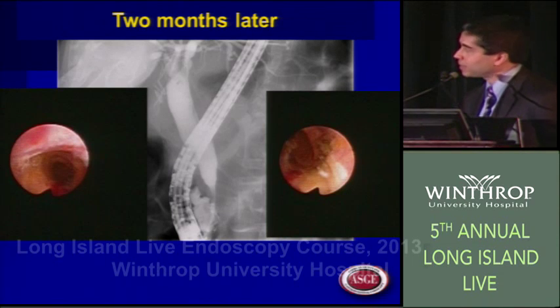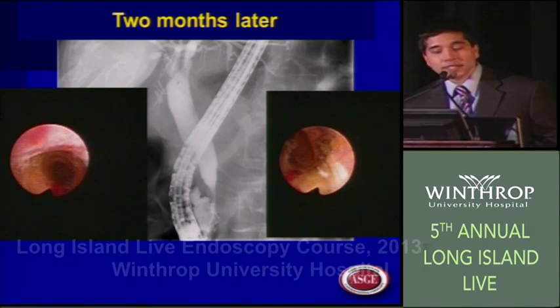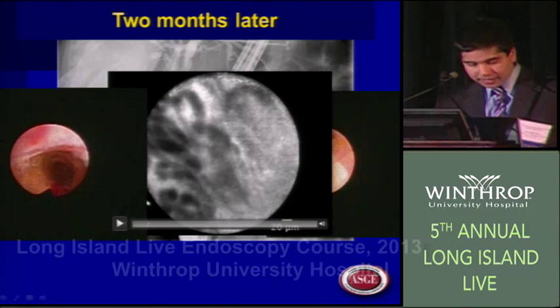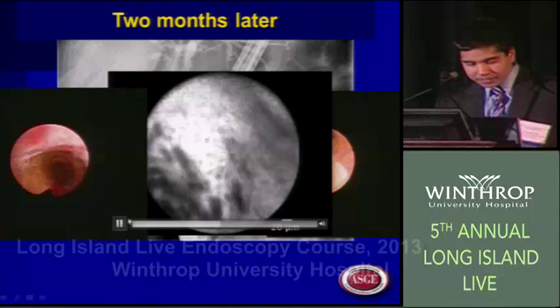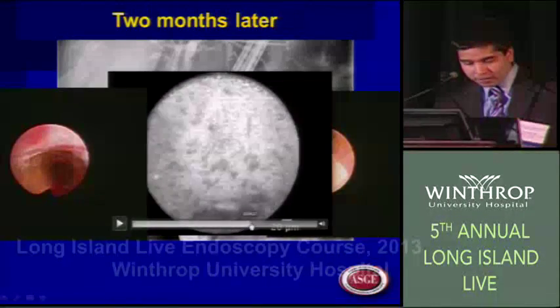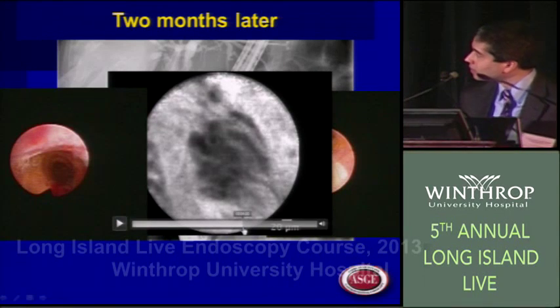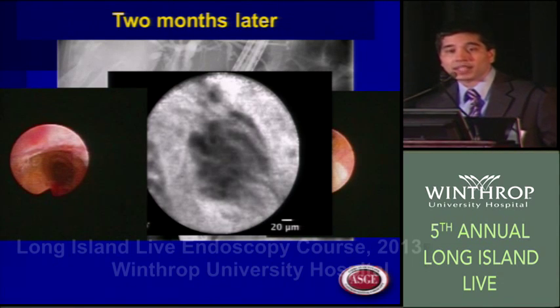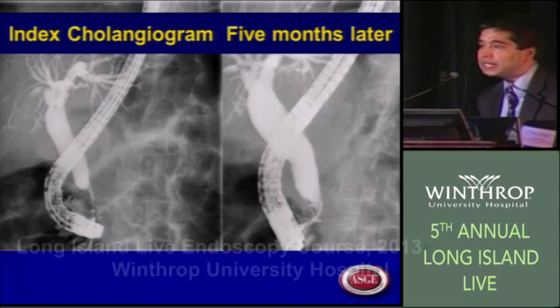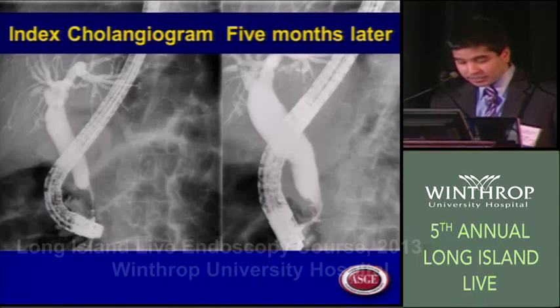So 2 months later, she underwent a cholangioscopy, and you see some irregular margins to the stricture. There's an ulceration, asymmetry, slight infiltration. It makes you worried a little bit about malignancy. So we perform confocal microscopy, and I'll pause it right around there. With the system now, you can actually pause and go forward and backward, and you'll see what's been described in the recently published Paris classification, where you see some thickened reticular pattern, which is likely inflammatory changes, not just benign, healthy changes, but nothing that looks dysplastic or malignant. In fact, with multiple stenting, 5 months later, this is how the stricture looked. Now at about 11 months, she's doing well clinically, still having pain, but not having continued weight loss and no signs of malignancy.